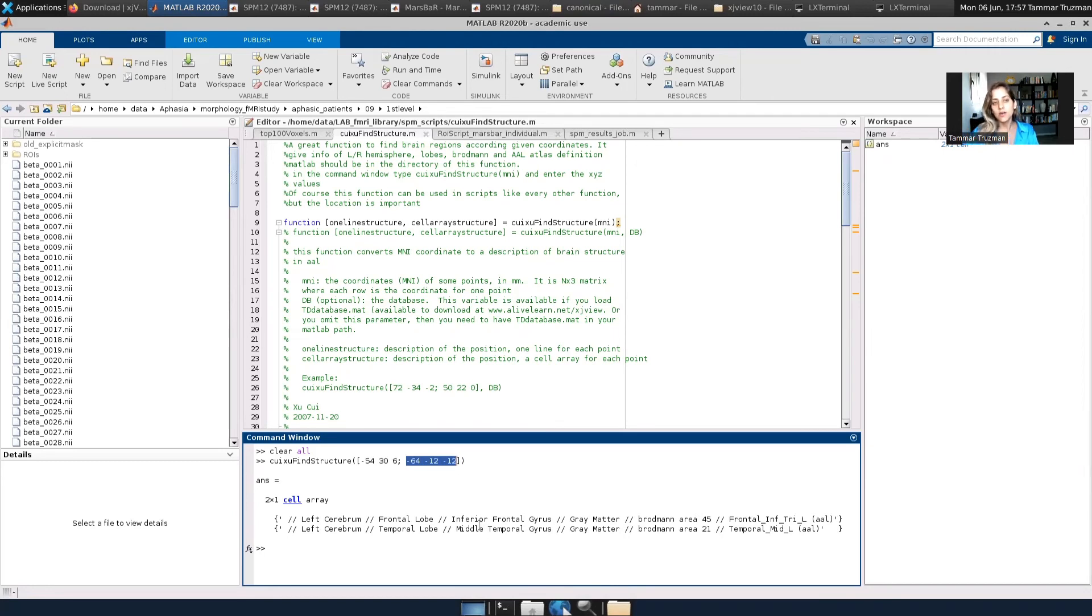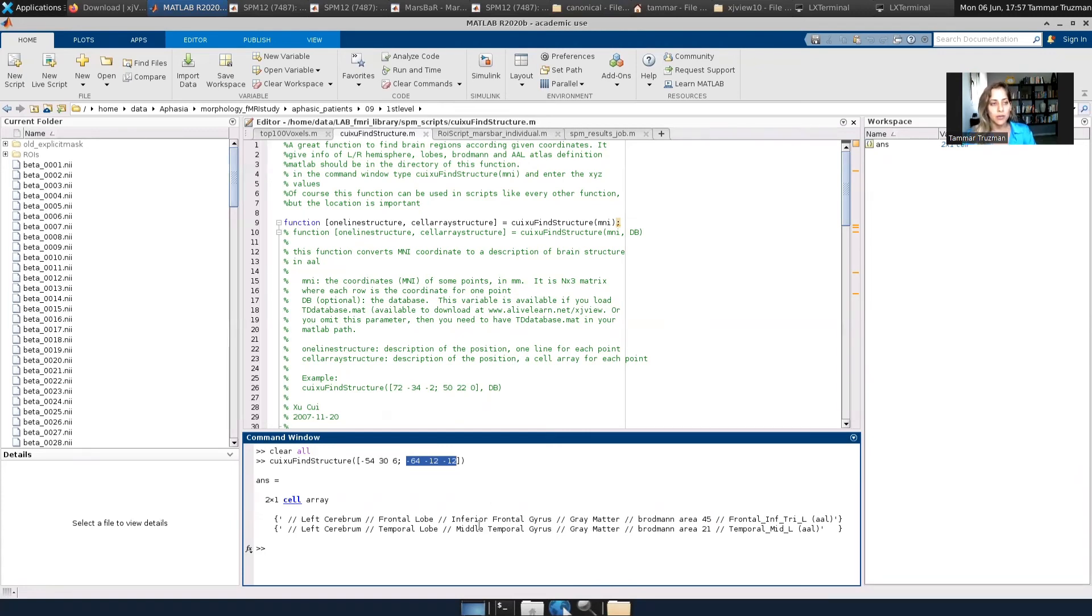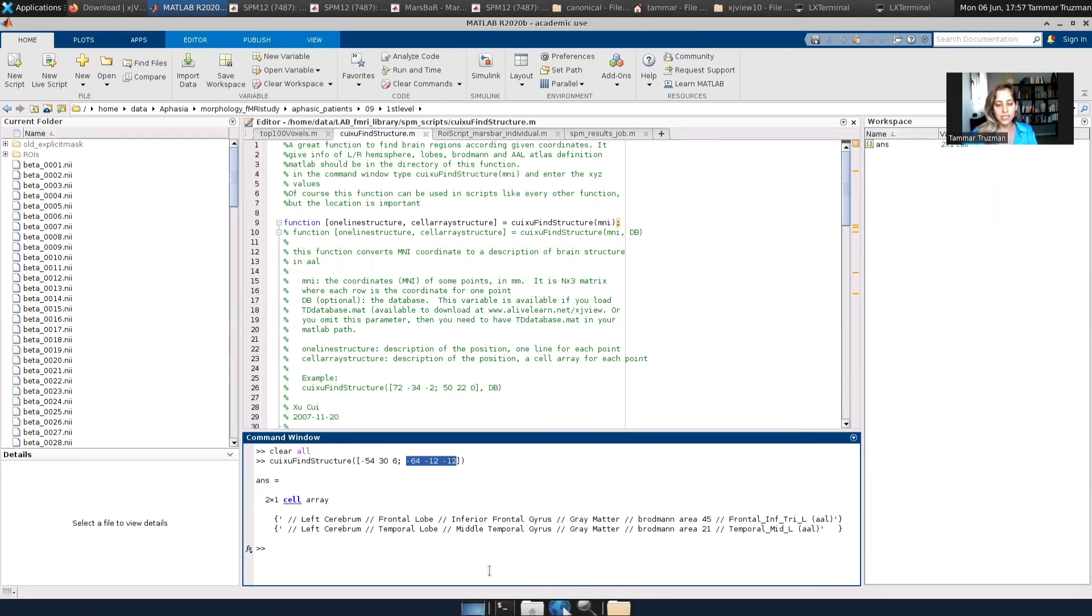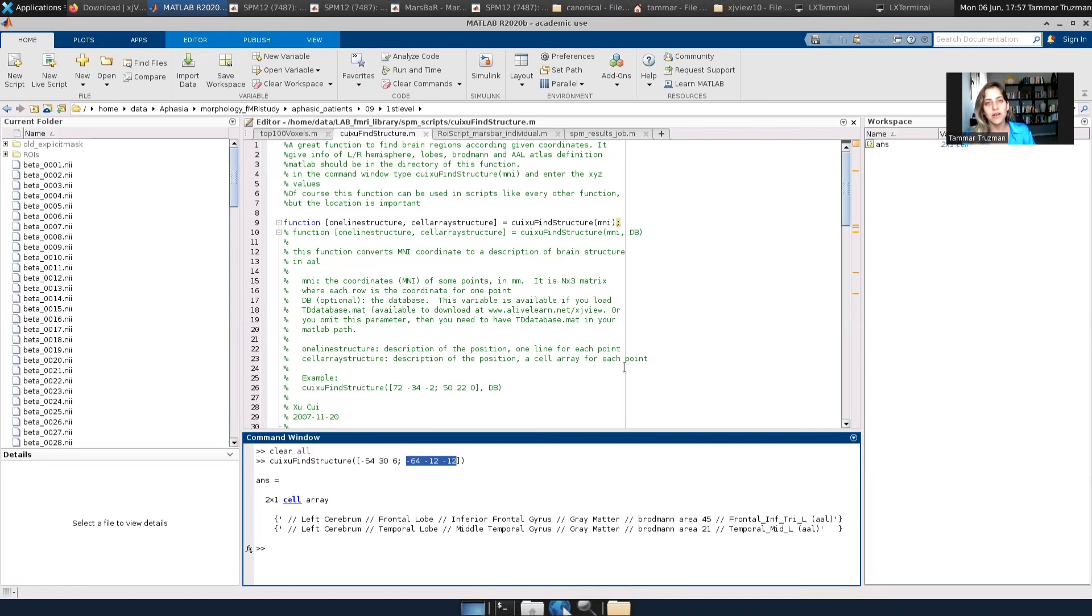So you can combine this function within scripts you're writing. You can type in many, many coordinates at once and get the right information. I think whenever it's white matter, it says white matter. Whenever there is no Brodmann associated with the coordinates, it says undefined. But it's based on the AAL Atlas, the Brodmann Atlas, and you can trust it.